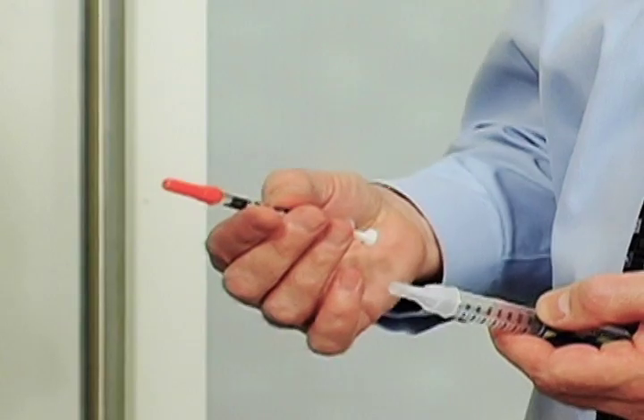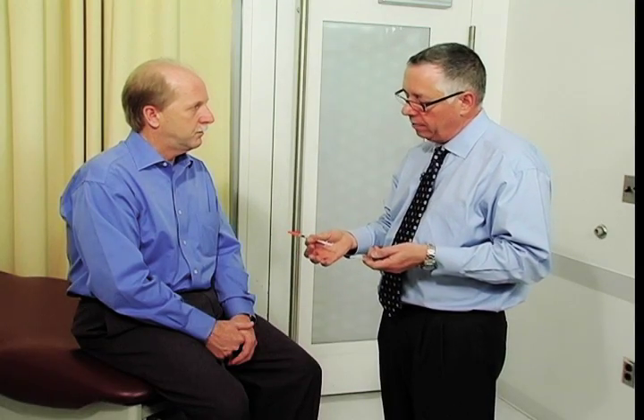Regardless of what insulin we use or what device we use, the technique that we utilize to inject is virtually identical. Today we're going to be using an insulin syringe to teach you. It's one of the simpler ways of doing it, and I think you're going to find this to be an incredibly painless experience in spite of any apprehension that you may have.